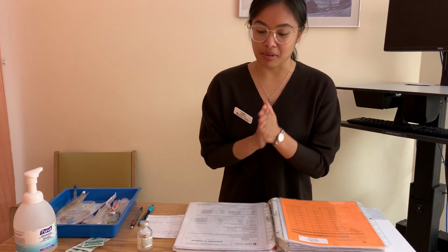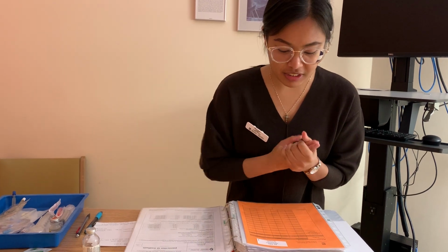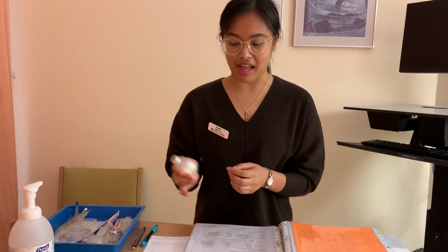Now I'm just going to review my information such as patient's name, diagnosis, and allergies. So I have here my patient is Erica, and she has pneumonia right now, and she's allergic to shellfish. And I already would have pulled up my medication from the Pyxis machine prior, but for the purpose of the video, I have it on hand.